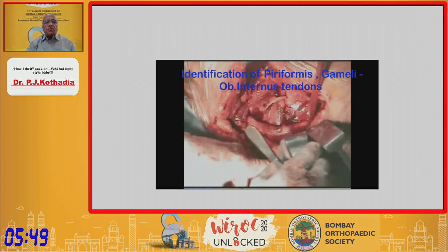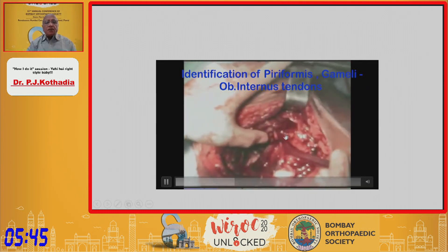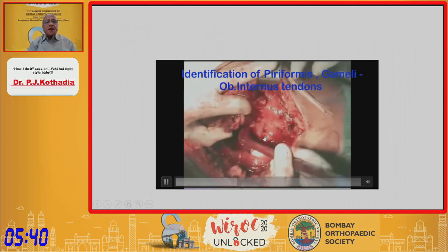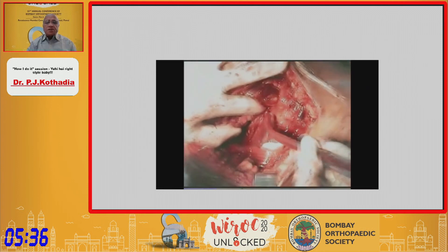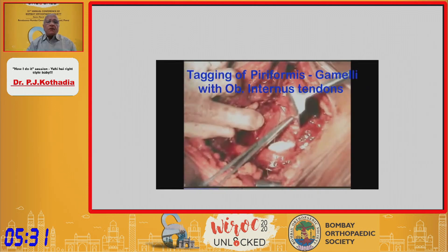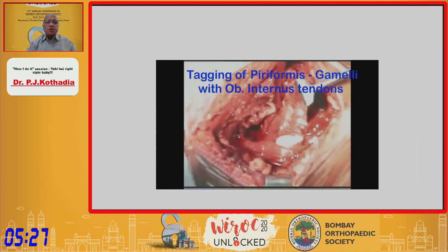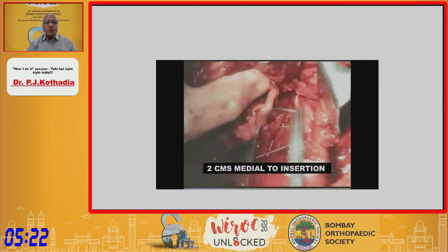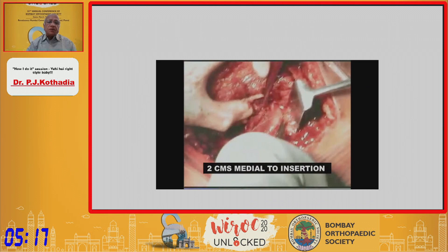The next step is identification of the external rotators. You see the sciatic nerve in the depth and the rotators from top to bottom are: piriformis, gemellus superior, obturator internus, gemellus inferior, and quadratus femoris. You have to pass tagging sutures one by one through the rotators, leaving the quadratus femoris — do not touch the quadratus femoris. The reason is that the circumflex vessel supplying the head of the femur runs underneath the quadratus femoris.